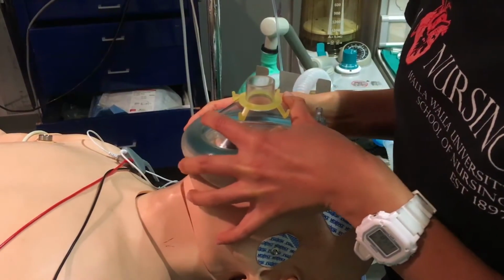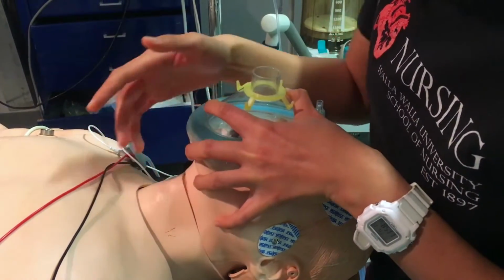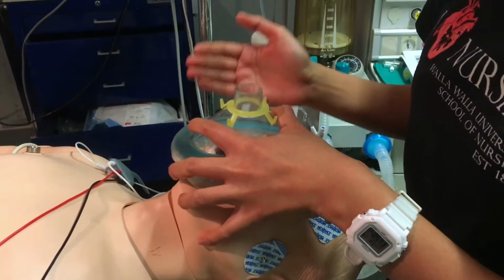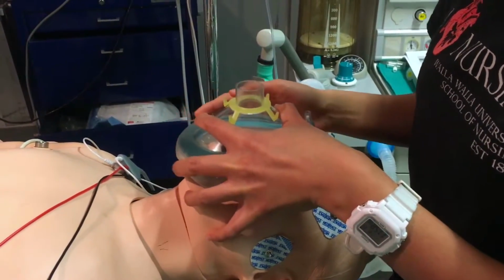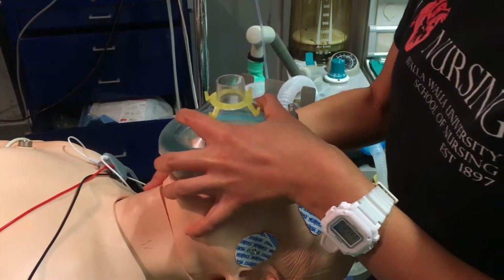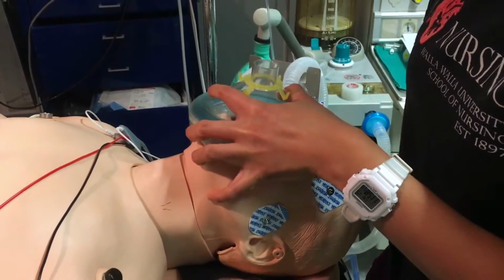With these 3 fingers, you put them basically underneath the chin along the mandible, only on the bony side, because if you do the soft tissue, that can cause tissue damage for the patient, which is not cool. So once you have that in this position, you do basically a head lift jaw thrust type of move where the head can kind of go back like this.